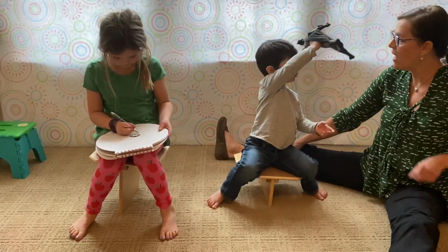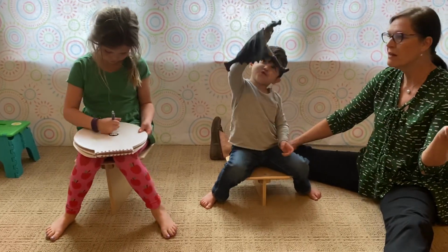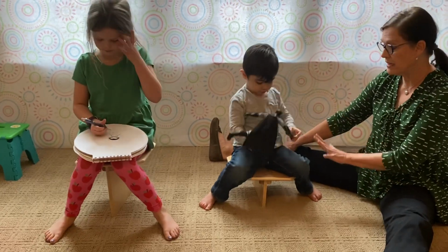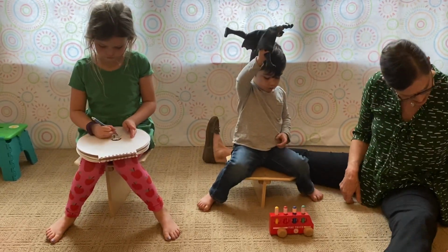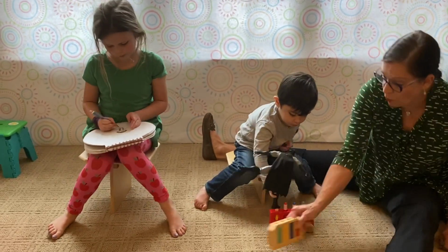And this little one over here has never sat on a T-stool until just now, and she's mastered it easy. And he's flying, he's crossing midline, he's using trunk rotation. So ask them to use their favorite toy and just stabilize on the T-stool. Then we can work on the up and downs and the postural control using a variety of toys that seem natural.